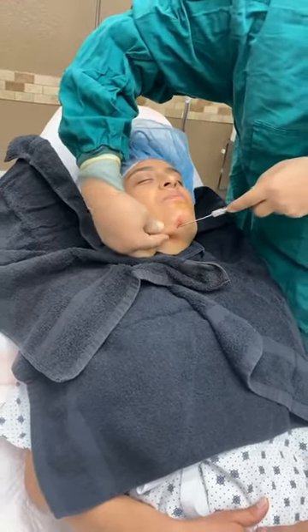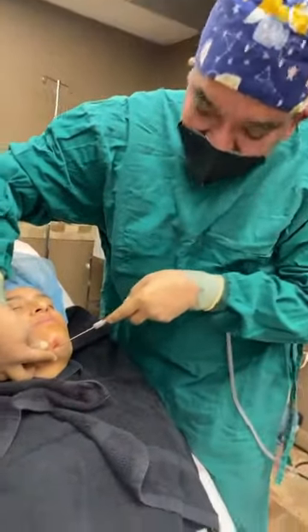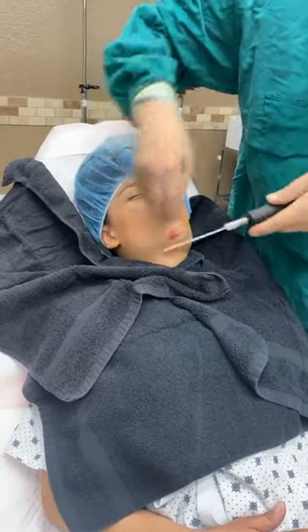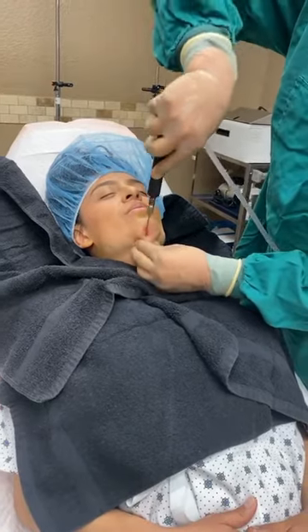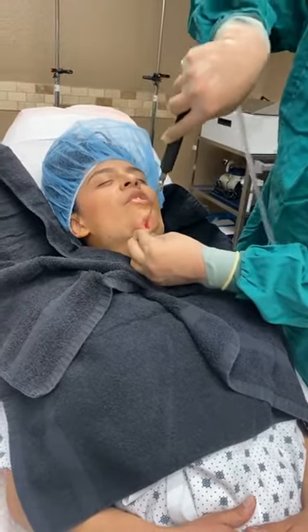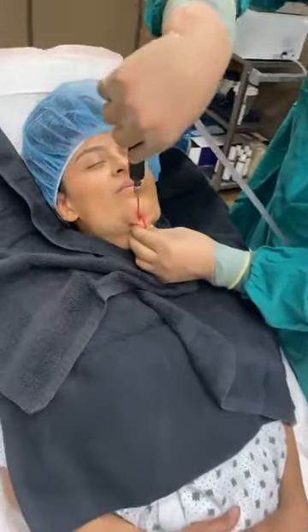Since I don't want to go back on this procedure in case I miss something, that's why I'm taking my time. Normally, this is a 5-minute procedure. Like I said, it takes longer to numb than it does to remove the fat. And her main complaint is right here underneath her chin. And so I'm making sure that I'm getting there.